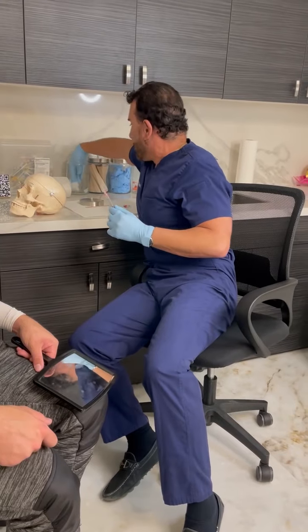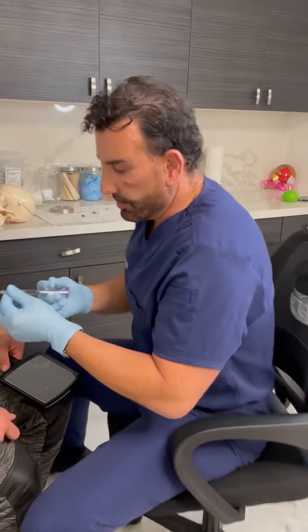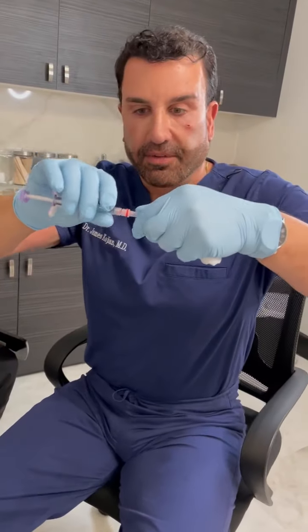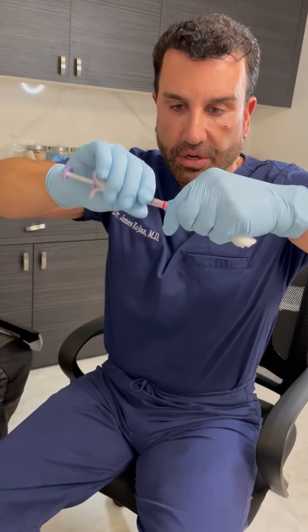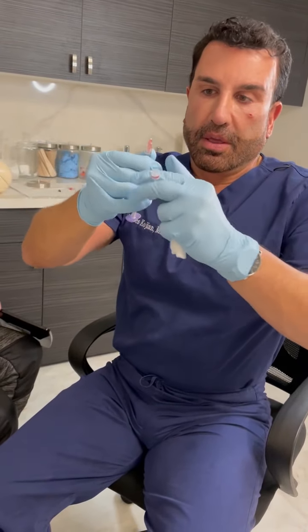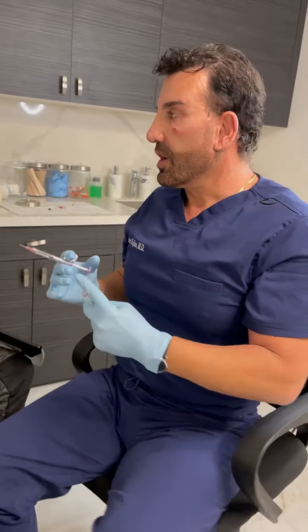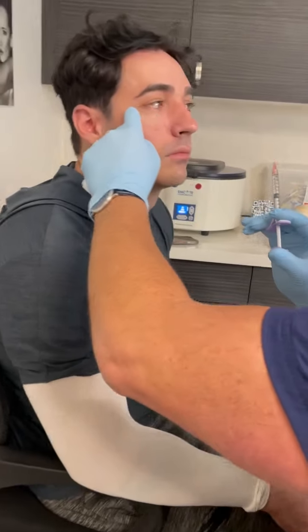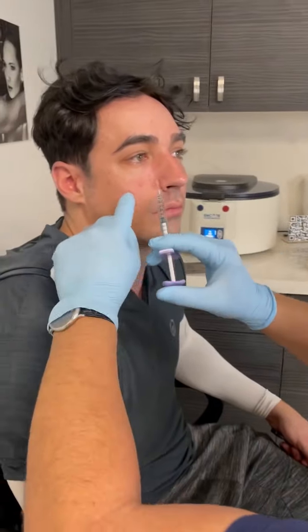You ice before if someone's prone to bleeding, but ice is good for pain. Now make sure that you put the needle on really tightly. I've explained this in other videos that it has to be cinched on. Cinched on. You see there's still room. Now it's cinched on. So this is a needle. You can use the needle that it comes with, it's fine. And so we're going to create that same volume that models have to give them that more 3-point promontory.